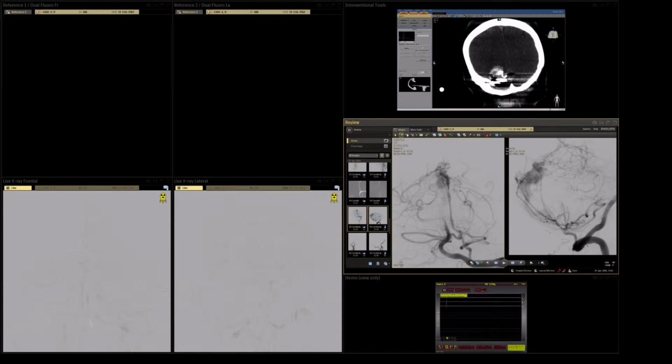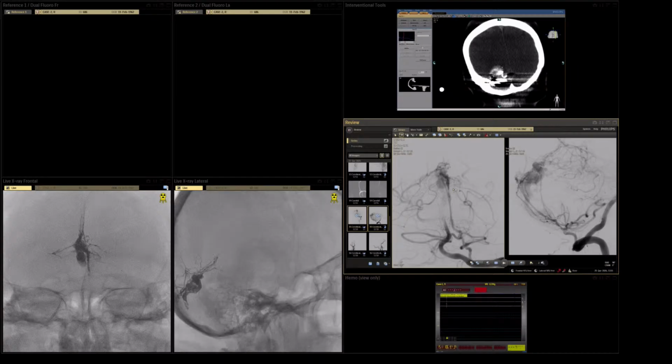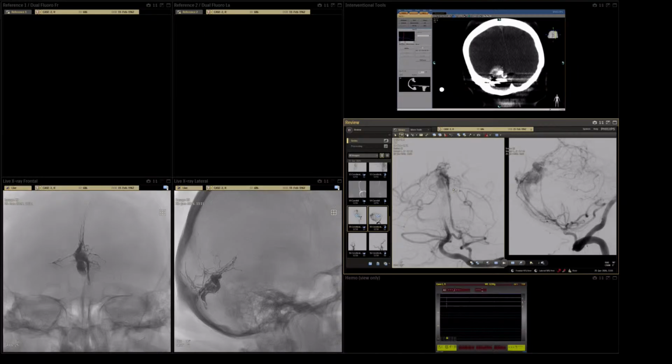Yes, it's okay. I will take out my Neuromax just to have less sources for emboli. Okay, let's give a little bit more.